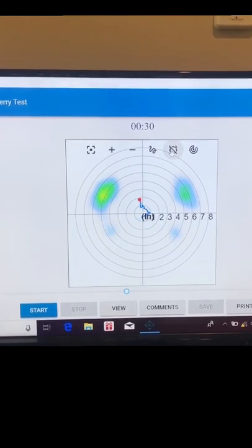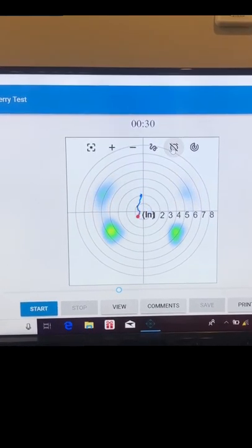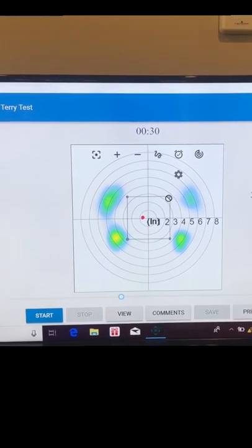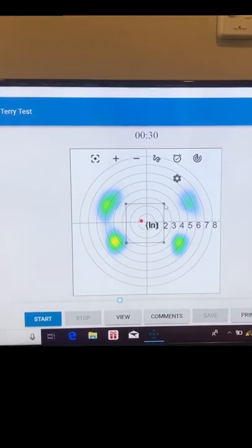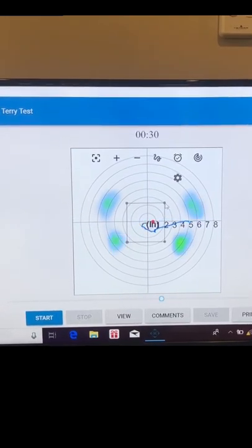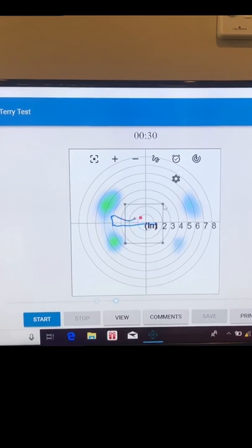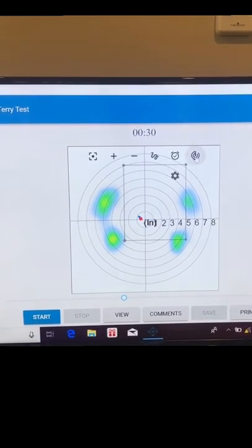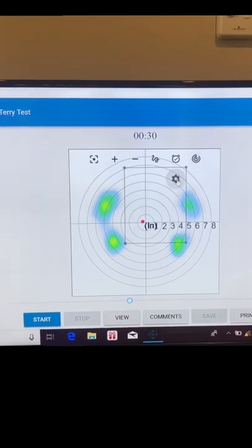There's an alarm feature here, so I'm going to get the patient to stand still. In this alarm, I can adjust the range to be bigger or smaller. So I'm going to get the patient to move outside of that range, for example. And now you'll hear an alarm. You can make this an objective, or something that you want to be notified of if the patient gets too far away from where you want them to be. So you can make this bigger or smaller.